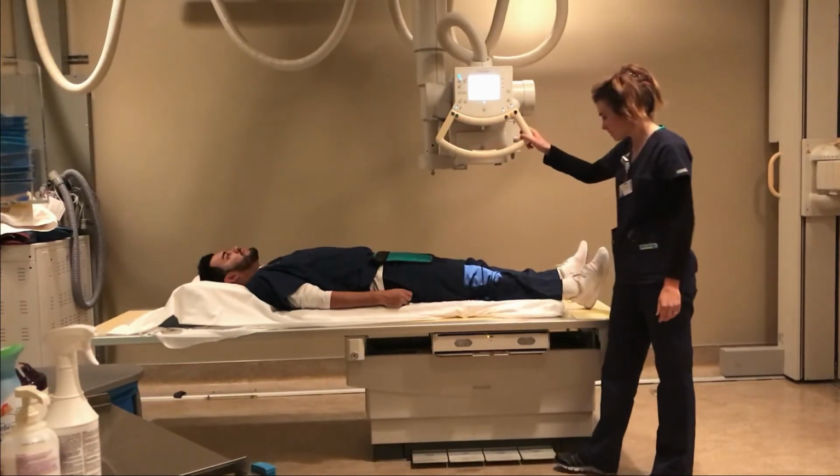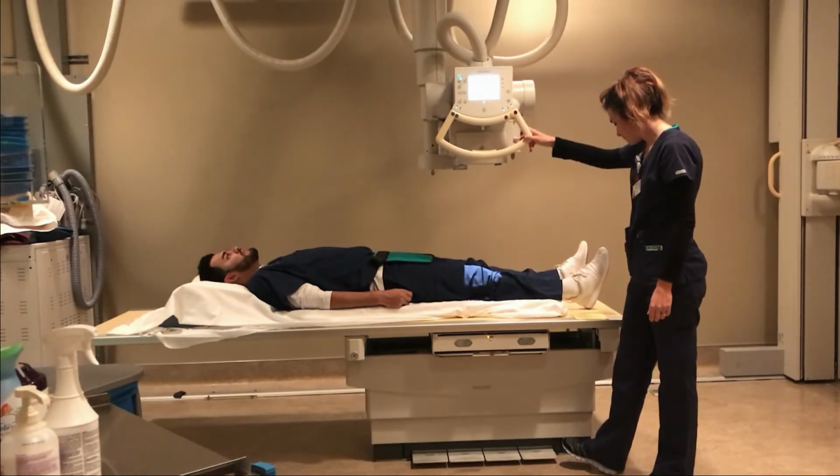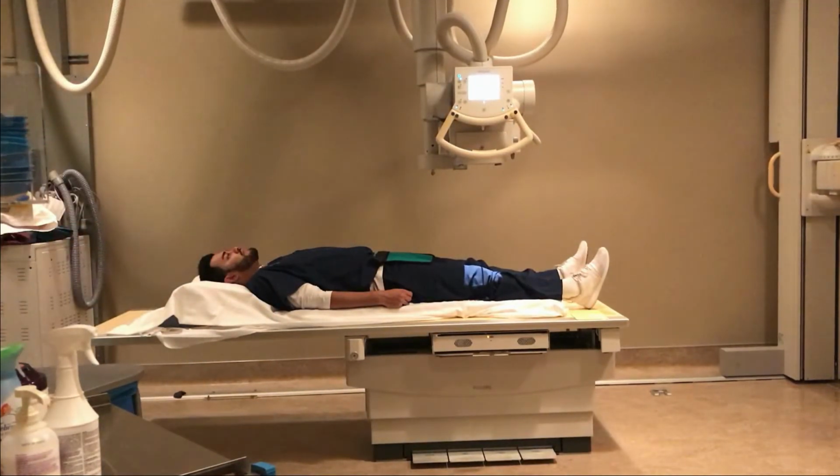There we go. Just collimating to the knee. So, alright, I'm going to go take the x-ray. Phil, just go ahead and stay still. Okay, x-ray. Beep.